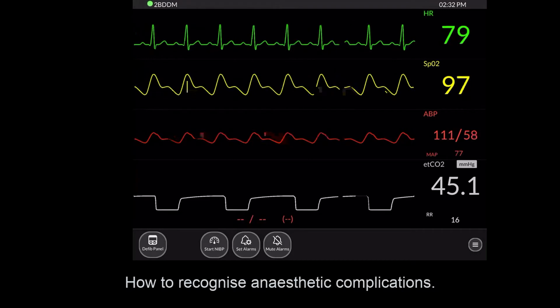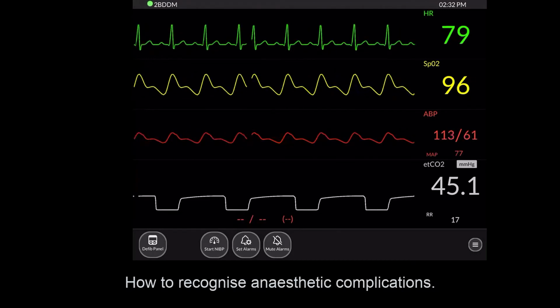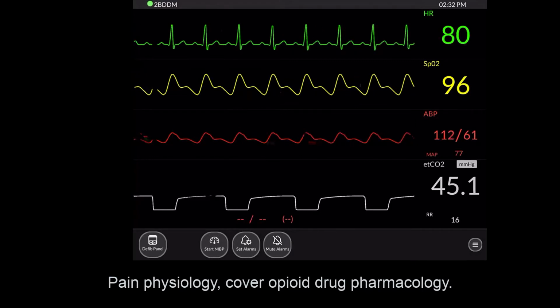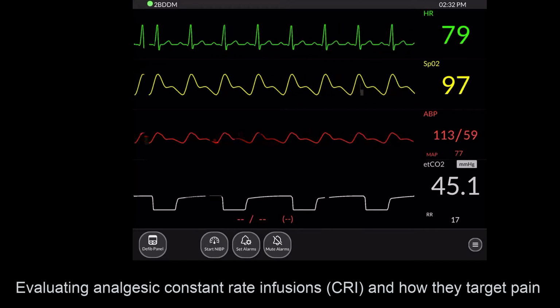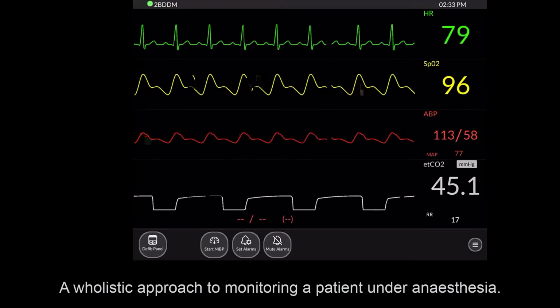They look really good. This animal is adequately anaesthetised and also has really good blood pressure and all of its monitoring parameters thus far. If I was monitoring this case, I'd say they are pretty good. I'm happy to just keep walking along.